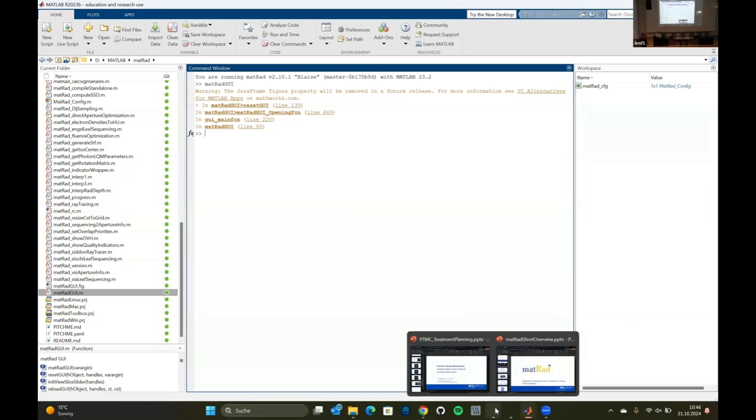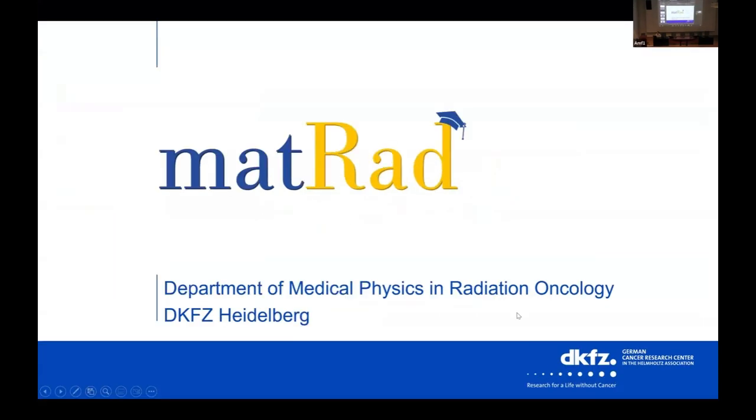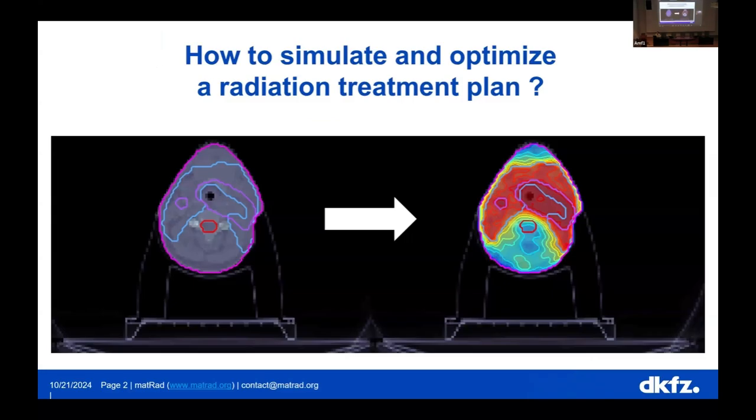Just really quickly, I will give you an overview about this treatment planning system, matRad, so you get a bit of an idea of what you are dealing with before we delve into hands-on planning itself. So let me quickly load a presentation. matRad is a treatment planning system, and we just had the presentation, which is very nice that this presentation was scheduled, so I do not need to talk too much about how to set up the geometry of patients and so on anymore.